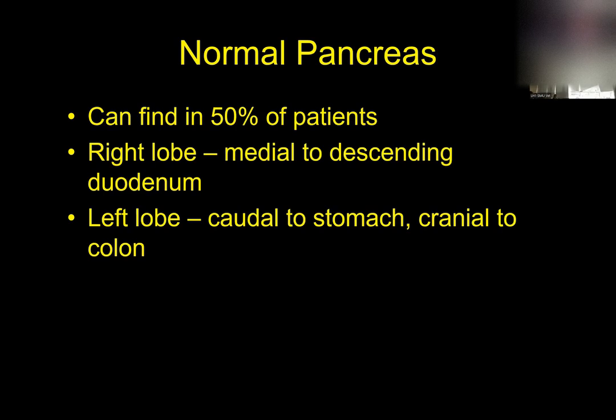Sometimes you can say, here's the definitive pancreas that looks very normal, but a lot of times you're looking at it and saying, here's where the pancreas lives, it's the pancreatic region. I don't see any abnormalities, but I really don't define a normal pancreas either.